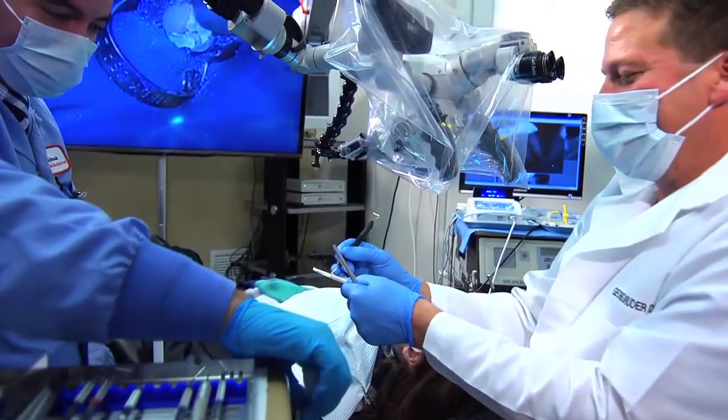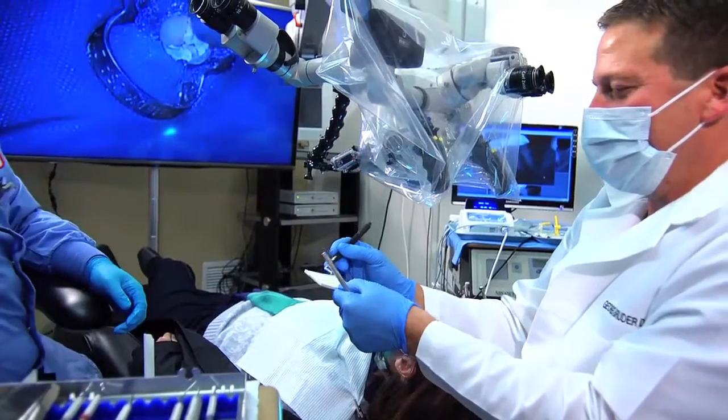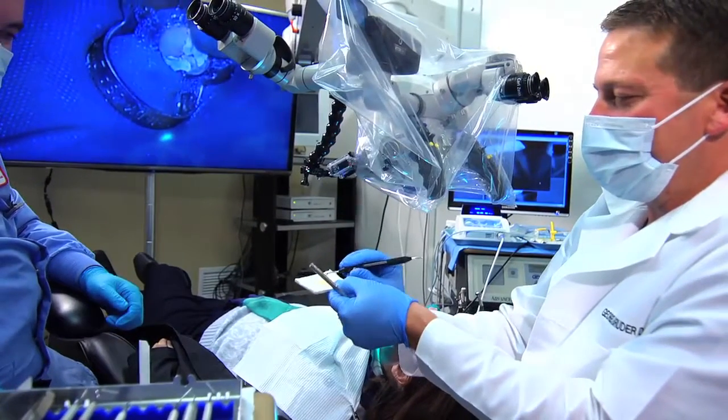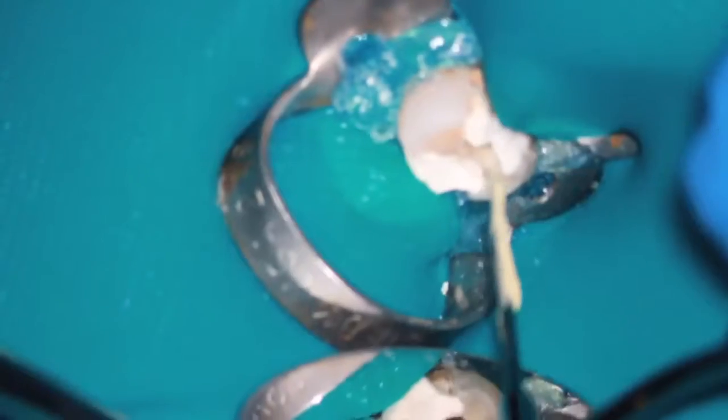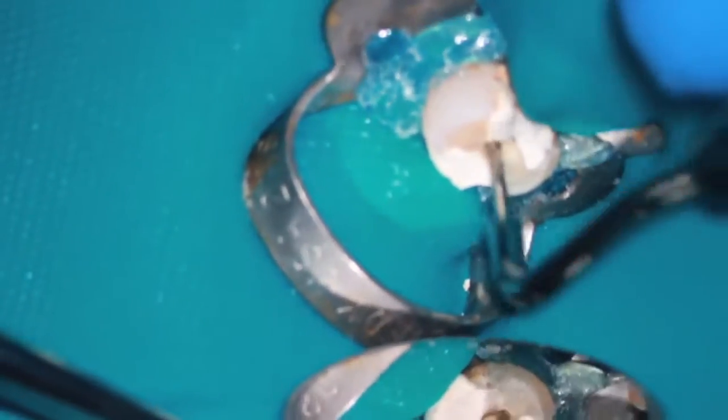One of the key things we have to remember is that gutta percha, for adhesive properties, does not really stick to dentin. So what we do is we put a nice fine layer of our sealer back in our canal after our burn down, because we actually got rid of it. So now this is our lubricant and adhesive again, just a thin coat like that, not much.